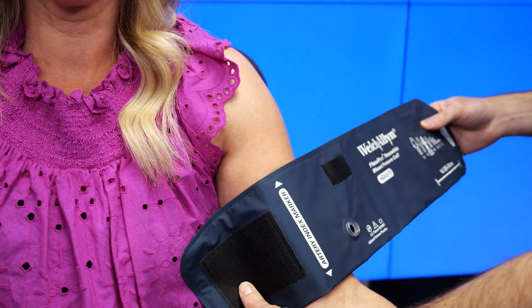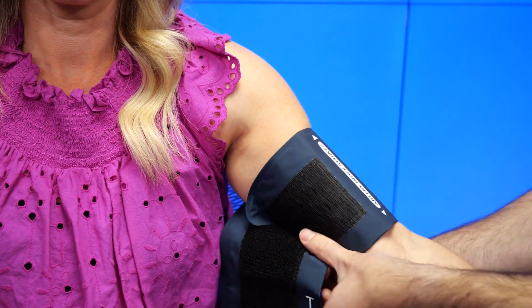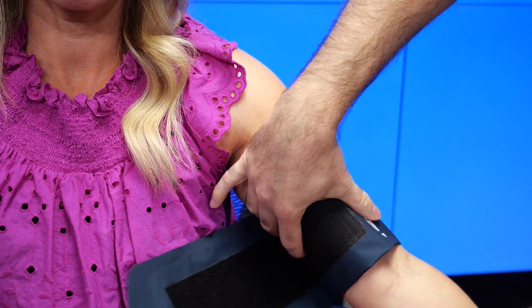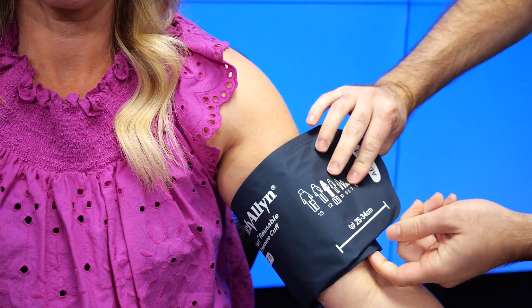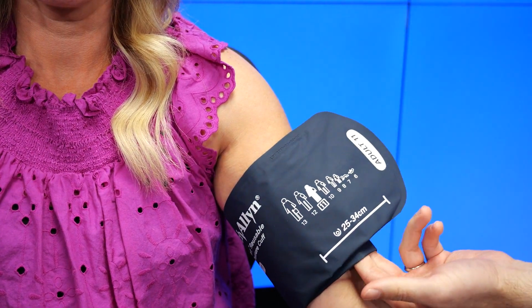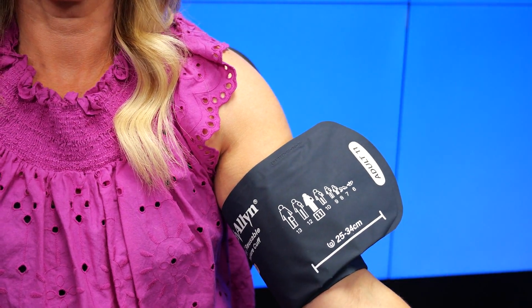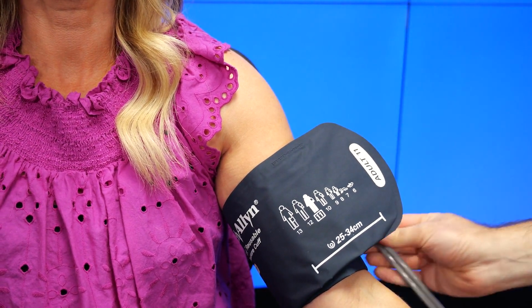To take a blood pressure, use the range indicator on the cuff to determine the proper size. If 2 cuff sizes fit the patient, use the larger of them. Make sure to place the cuff on the bare upper arm, aligning the cuff marker to the brachial artery. Apply the cuff snugly, allowing room for no more than 2 fingers.